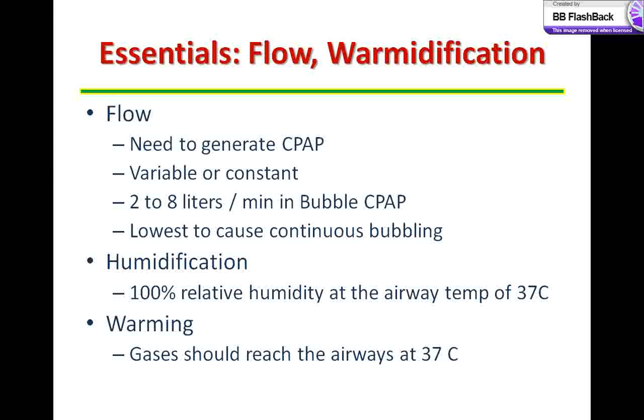Humidification should be about relative humidity of 100% and a temperature should be at 37 degrees when the gas reaches the patient interface.